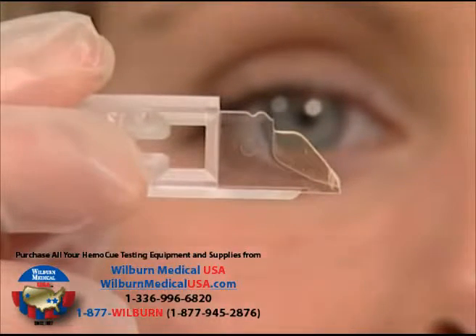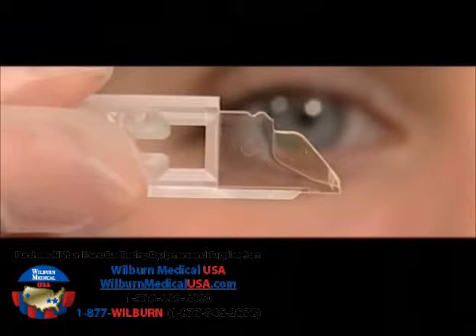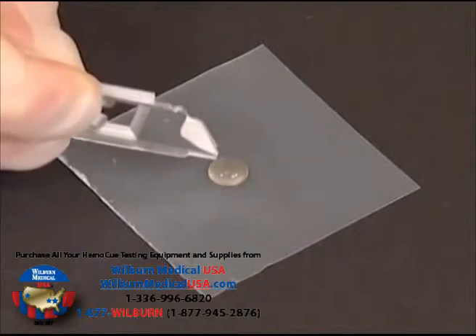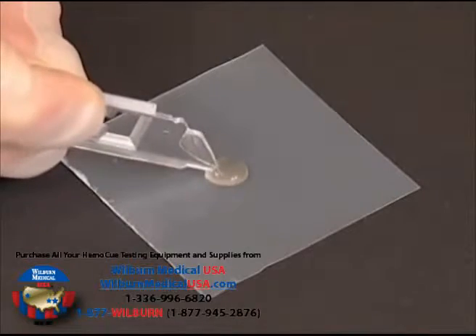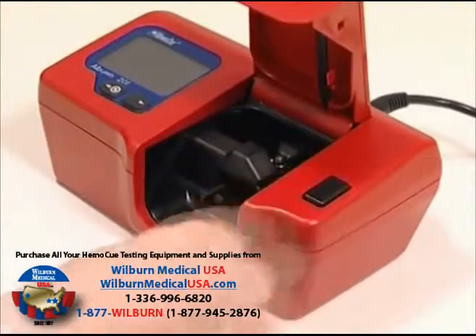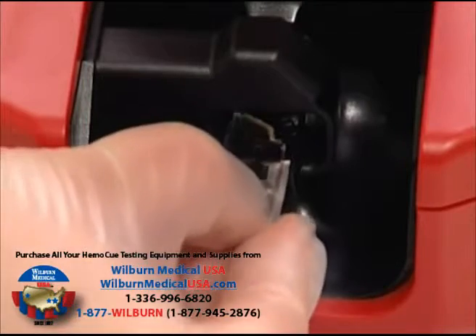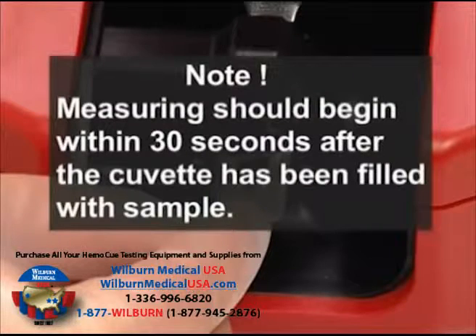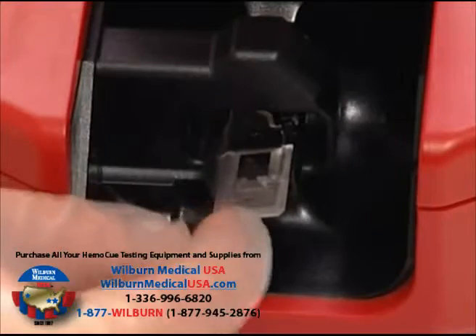Look for air bubbles in the microcuvette. If any are present, the cuvette should be discarded and another microcuvette filled for analysis. Next, open the lid and place the filled cuvette into the cuvette holder. This should be performed within 30 seconds after filling the microcuvette. It is important that the cuvette snaps properly into the cuvette holder.